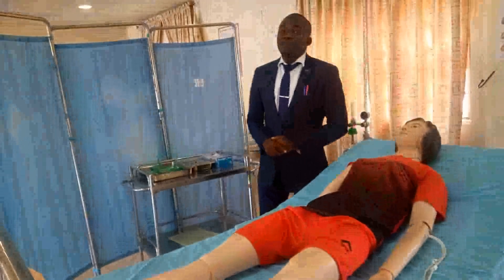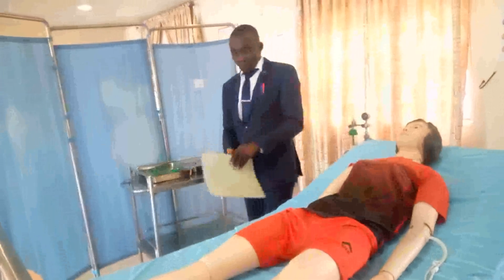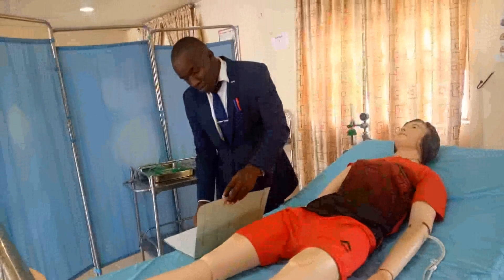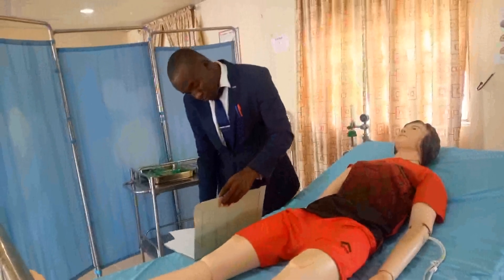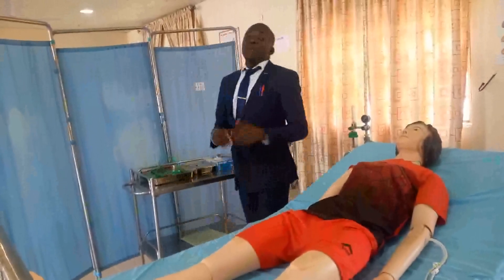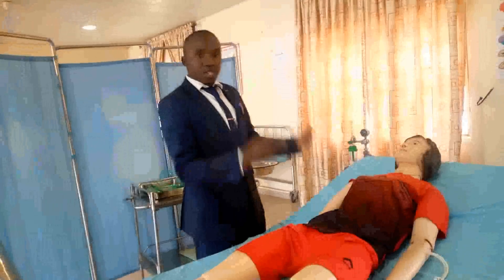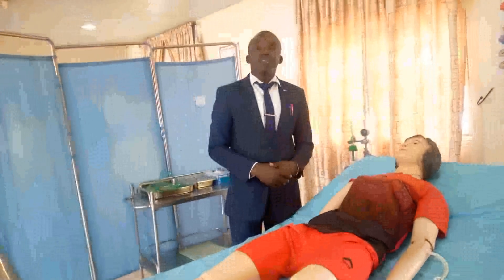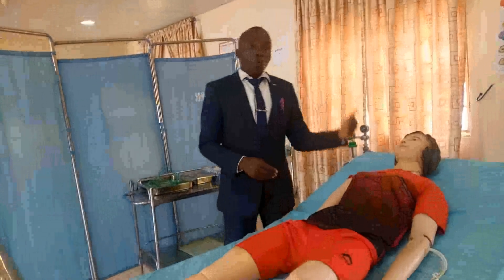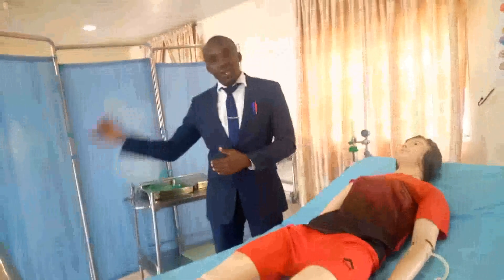In the preparative phase, you have to verify the routine order and check for the prescribed amount of oxygen to administer to the patient. If the patient is conscious, you are to meet the patient, greet them, introduce yourself, and explain the procedure. If the patient is unconscious, you have to meet the patient's relations.